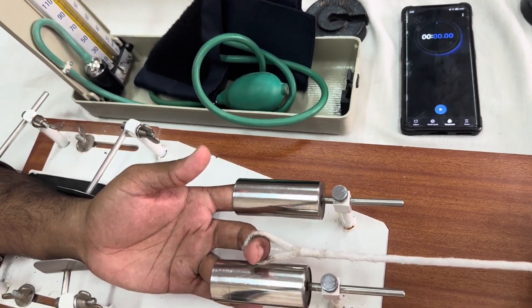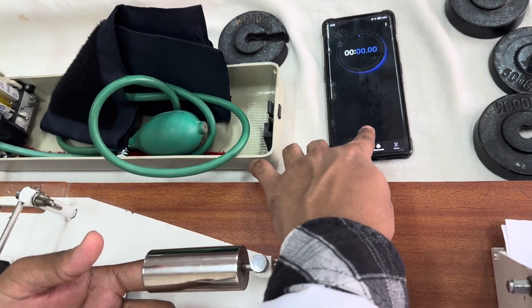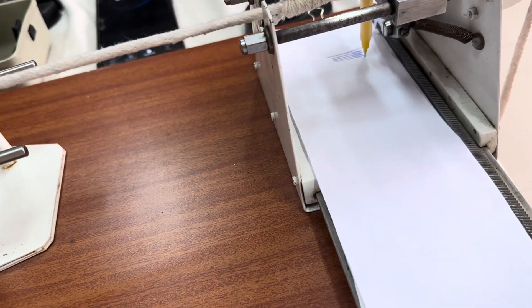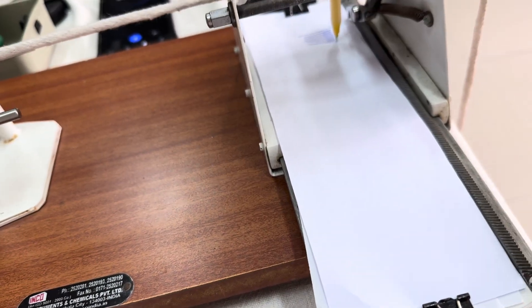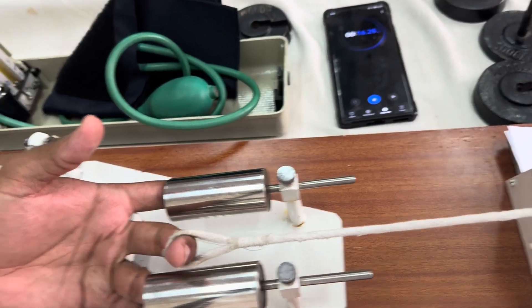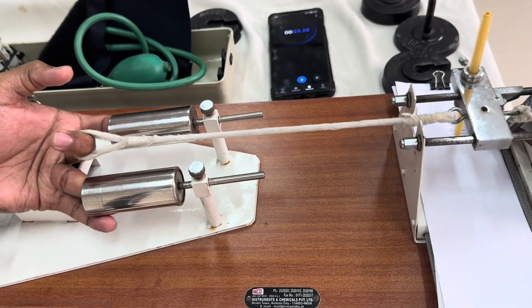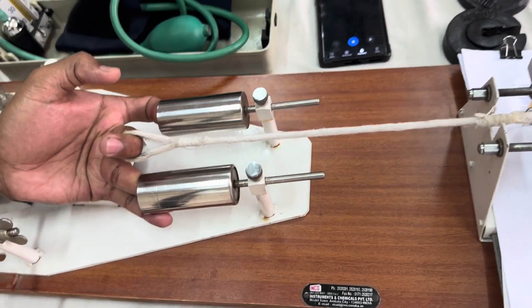We are now taking one minute at 60 contractions, one per second. Once I say start, the subject will begin contracting the muscles. So we will start the procedure — start. You can see the writing lever moving as the person contracts. The lines recorded are known as an Ergogram, which is a graphical record of the contractions of human voluntary muscles. The procedure is known as Ergography and the instrument is known as Ergograph. It was first described by Mosso, hence it is called Mosso's Ergograph.